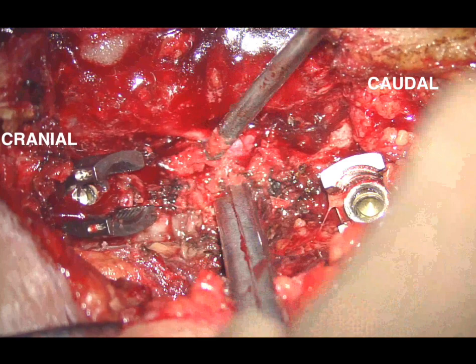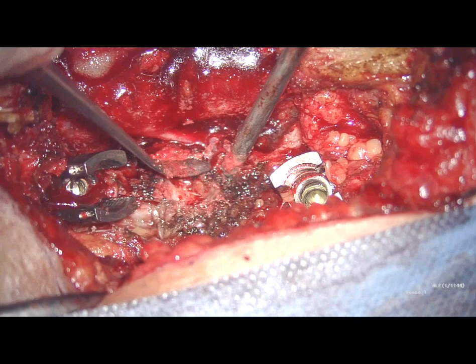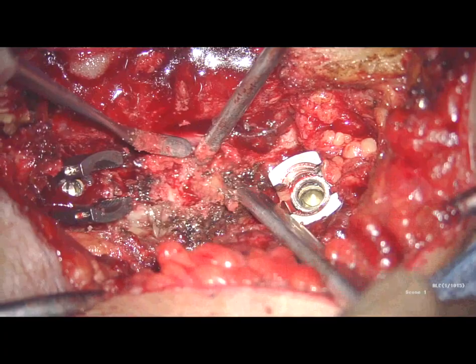Under fluoroscopic guidance, polyaxial transpedicular screws were inserted on L3 and L5 bilaterally and a total laminectomy of L3-L4 was performed. The facet joints are removed and the L3-L4 and L4-L5 disc spaces are exposed.